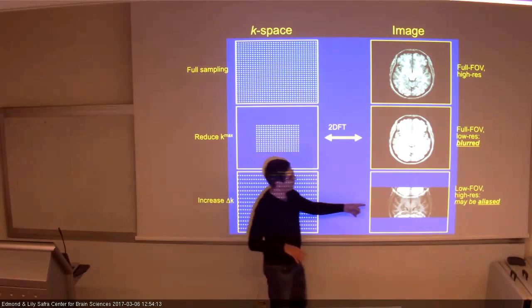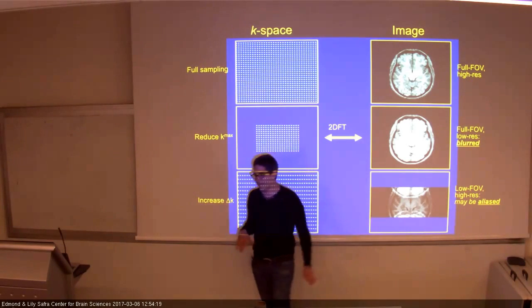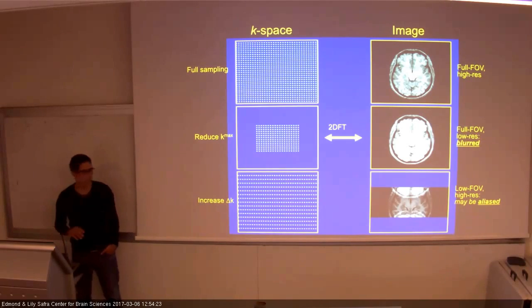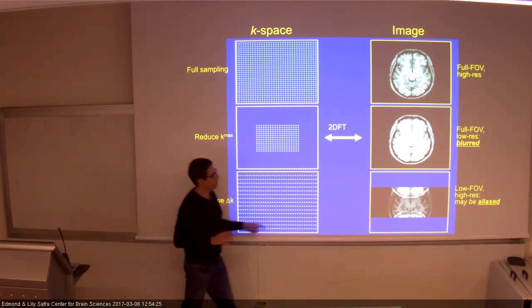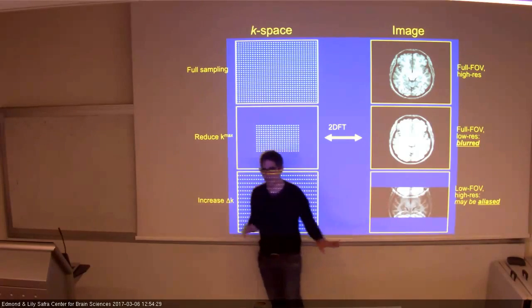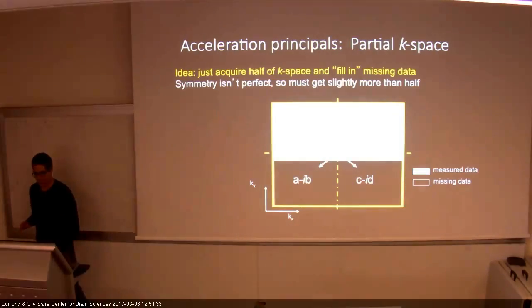That's what we have in here. And maybe you're playing with that a little bit at the table about aliasing. This folding is a huge problem, but it's also a great advantage for people who try to do acceleration. There are many interesting things with that.